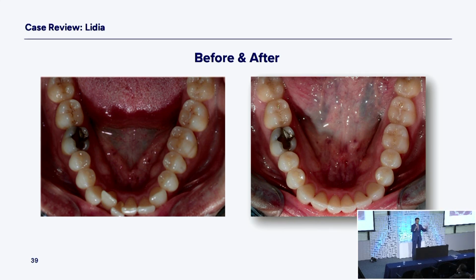Check out your molar width. Check out your premolar width. Check out your canine width. You've uprighted all these posterior teeth, and look at that number 17. Number 17 rotated to straighten out. That wisdom tooth number 17 is turned in. The contact point is weird. Look at 17 to 18, the contact point, totally normal.